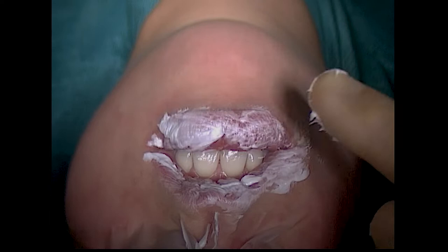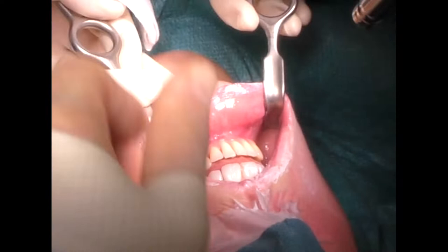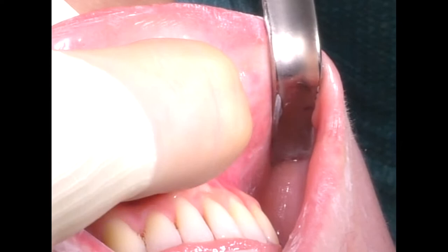We start the surgery by rubbing the lips with a steroid cream in order to protect them and keep them soft. Very often you can find the labial branch of the mental nerve shining through the mucous membrane and you can mark it out, left and right.